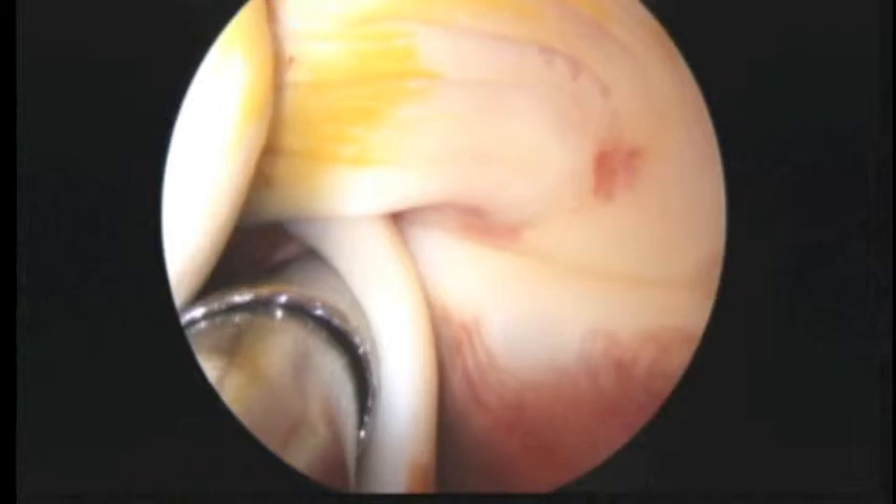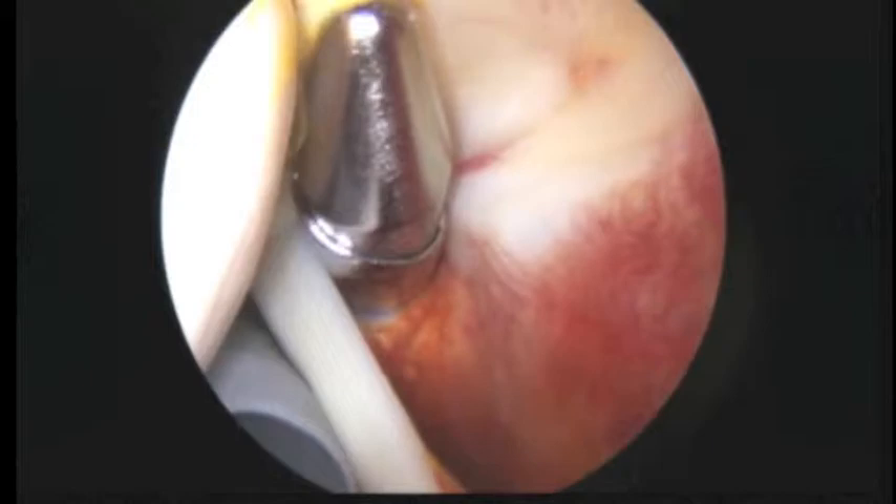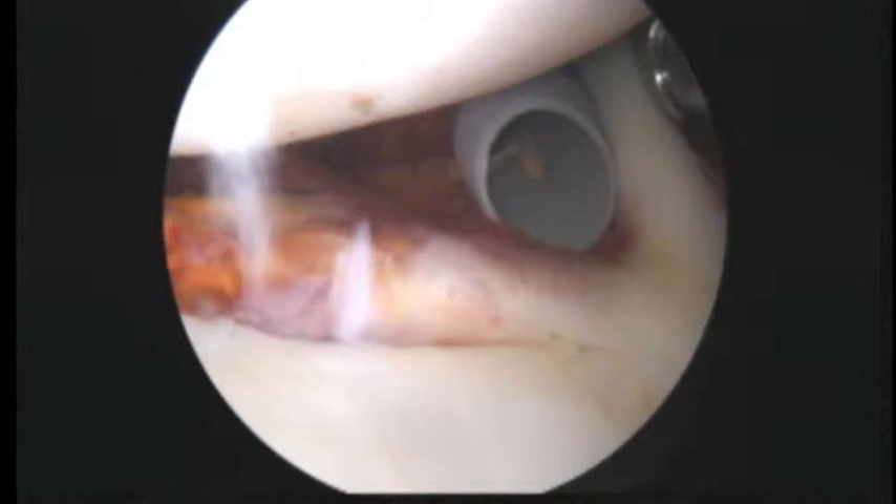As we look up at the rotator cuff, we thought that was okay based on your preoperative studies and we can confirm that now — this part of the rotator cuff looks just fine. We're going to swivel around and look at the back of the shoulder.